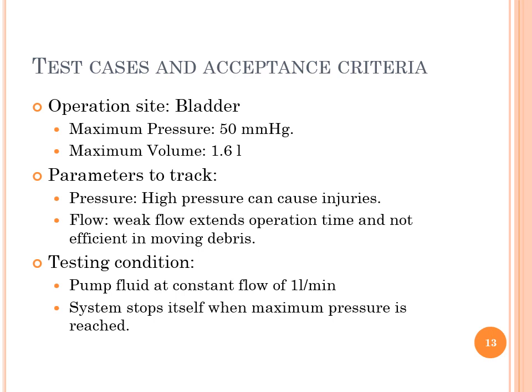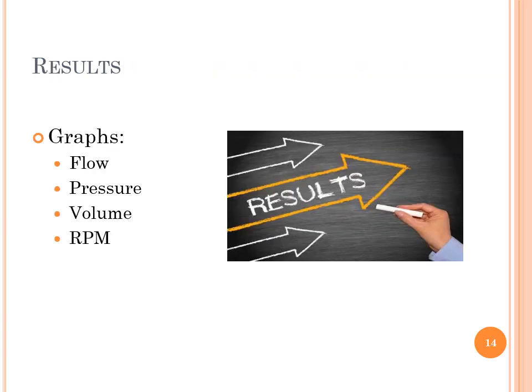For the testing, we turn on the pump and let it pump the fluid to the operation site with a constant flow and turn off the pump when the maximum pressure is reached. To ensure the efficiency of our model, we graph the following parameters to make sure they behave as expected: the flow result, pressure result, volume result, and revolution per minute result.